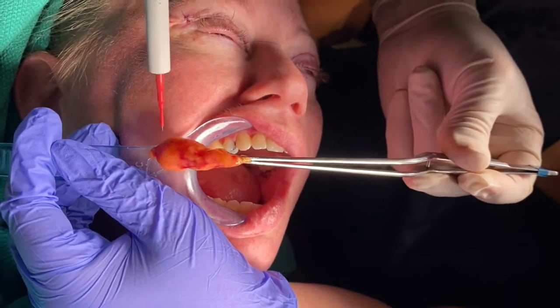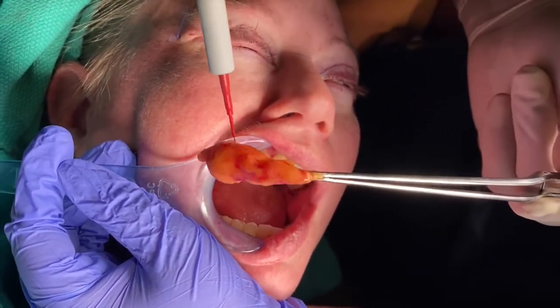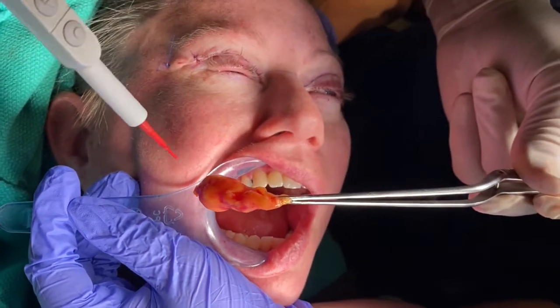So this is the buccal fat. You can see it goes right there in the buccal area of the mouth. You can see what a large piece it is, and it's a continuous piece all together — it's not a little lipoma. It's a very good fat for transferring, such as under the eyes or anywhere.